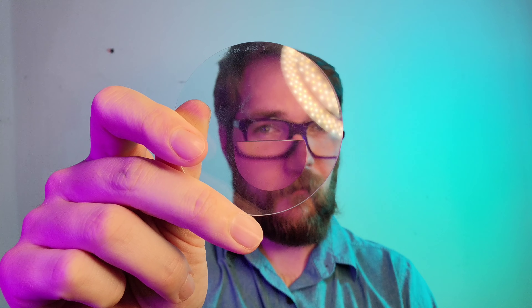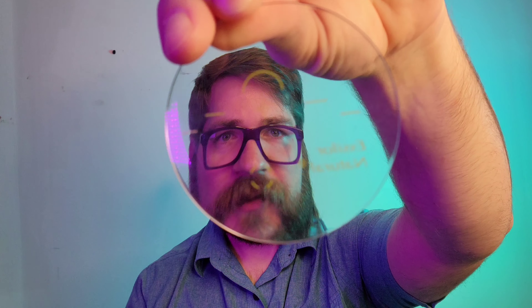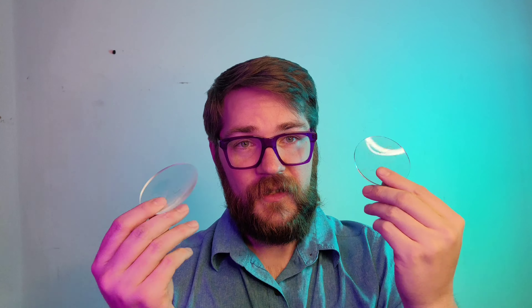Bifocal versus progressive — which would you wear? For me, it's more about exactly how you're using the lens. For that first pair, when you're at a 1.00 or 1.50 add, it's not going to make a significant difference except for the physical line and a little bit of image jump between the two — you'll see the image pop up just a little bit sooner with the bifocal. With the progressive, you don't get any sort of image jump; it's continuous from top to bottom. There is also something in between called a digital add lens, which I've talked about in another video.